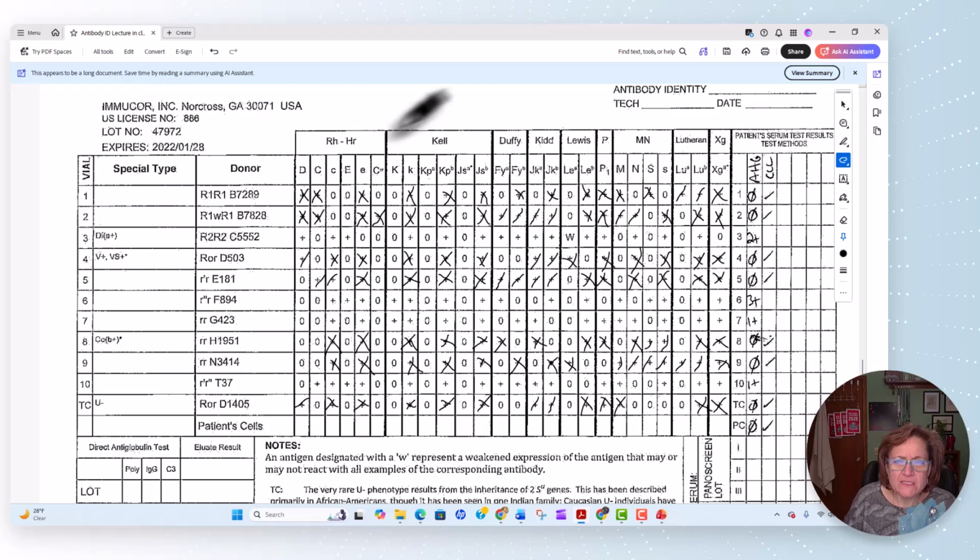Okay, so now let's cross off up above. Let's see where we're at. D's, I got 2, at least 1 homozygous. Remember, that's the rule. You have to have at least 2 cross-offs, and 1 needs to be homozygous. I can cross off C. I can cross off C. Nothing on the E, so we're going to write the 2 above the E. Little e I can cross off.